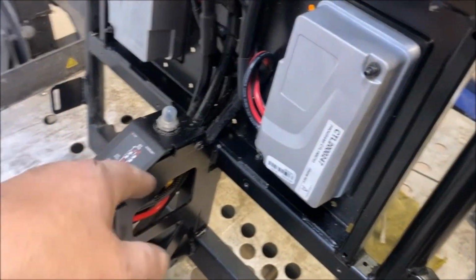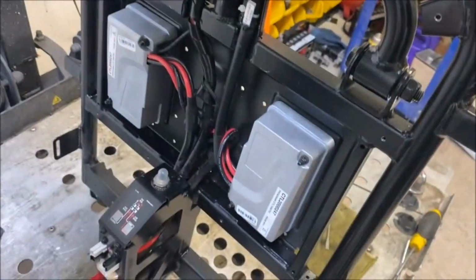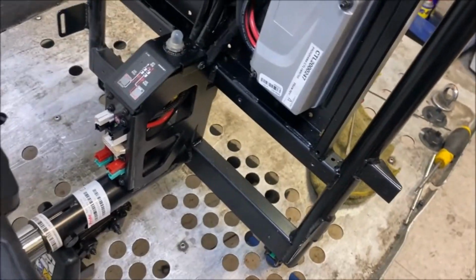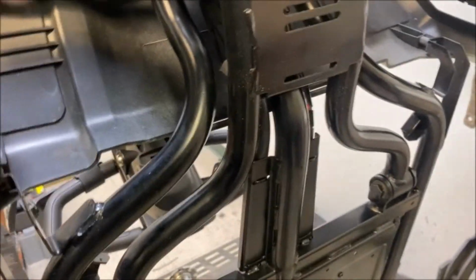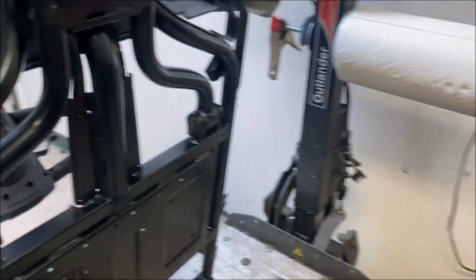Without having to undo this. So yeah, now I'll give it a quick clean up, got rid of the dust, and now I can go around and check all the nuts, make sure everything is tight. I'm going to take the wheels off, took the caps off. They're going to be a 13mm.